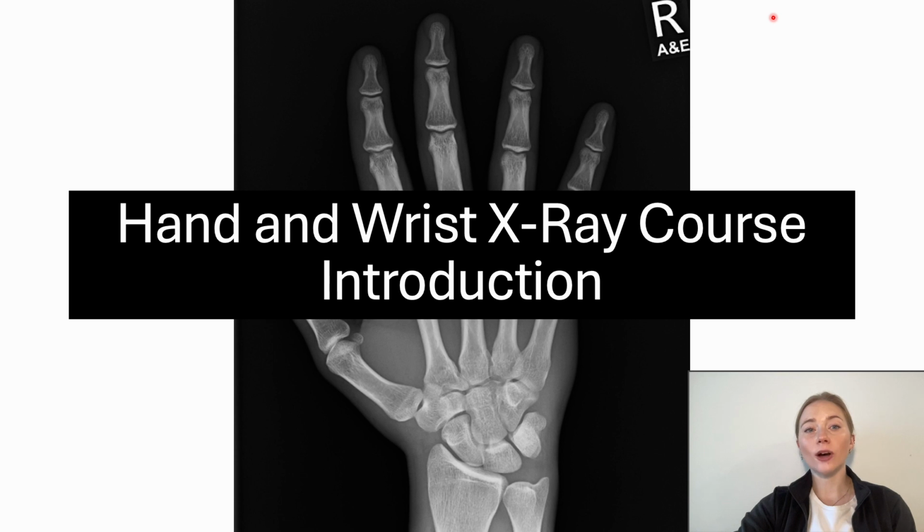The hand is anatomically complex with 27 individual bones, and it is prone to injury and trauma, making it important to understand the benefits and limitations of using X-rays to diagnose injury. The aim of this course is for you to become comfortable with an approach to reading hand and wrist X-rays and diagnosing common pathologies seen on these X-rays.